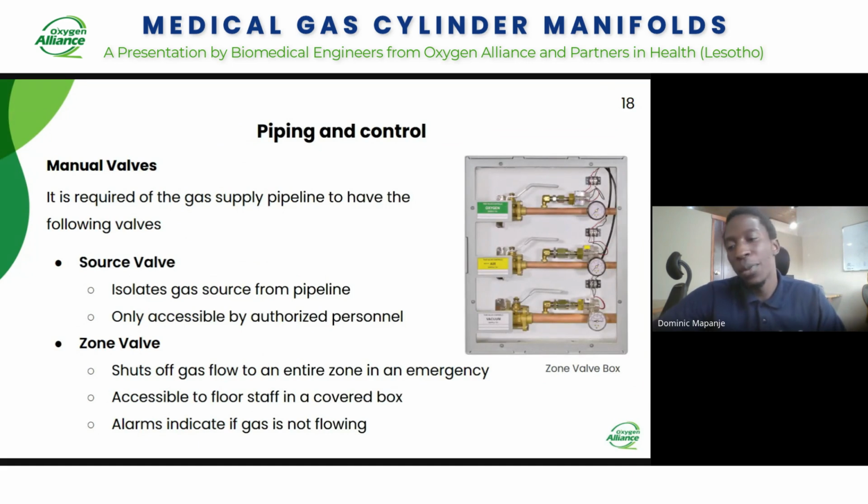So moving on to piping and control. We have said we have a manifold, and then we also have piping from the manifold to the facility that we are supplying the gas to.